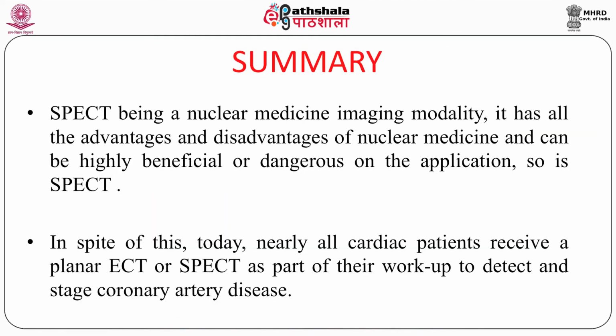In summary, we should say that SPECT, single photon emission computed tomography, being a nuclear medicine imaging modality, has all the advantages and disadvantages of nuclear medicine and can be highly beneficial or dangerous depending on the application. So is SPECT. Why even say disadvantages? When we talk about radioactivity, if you are not using it properly, or if some kind of misadministration takes place. But it is very advantageous. In spite of this, today nearly all cardiac patients receive planar, ECT or SPECT as part of the workup to detect and stage coronary artery disease.